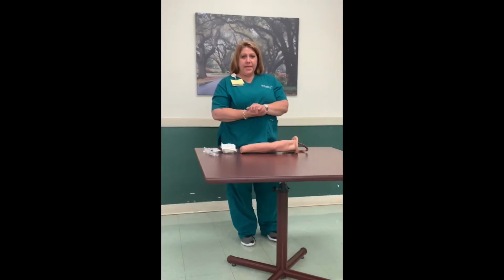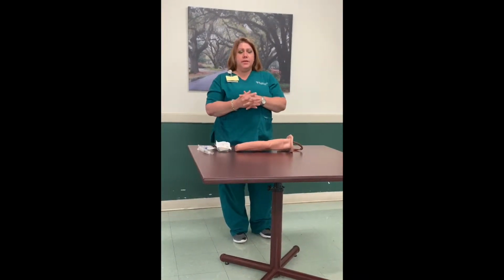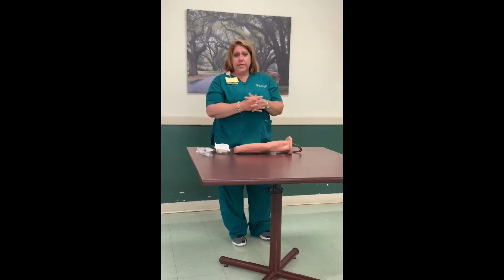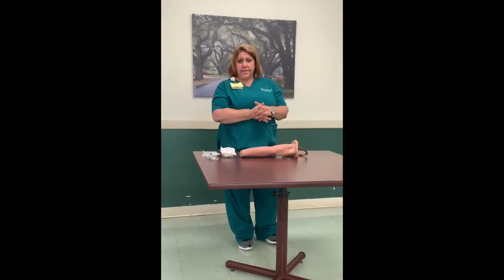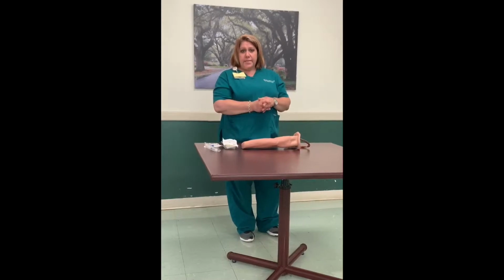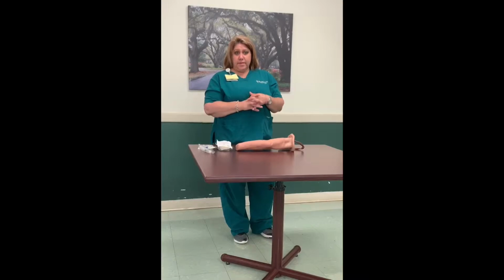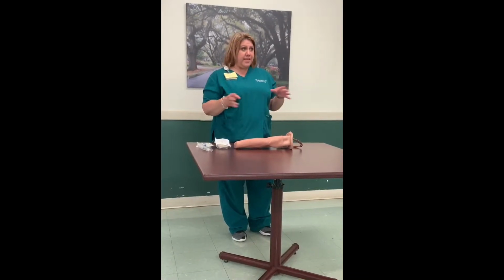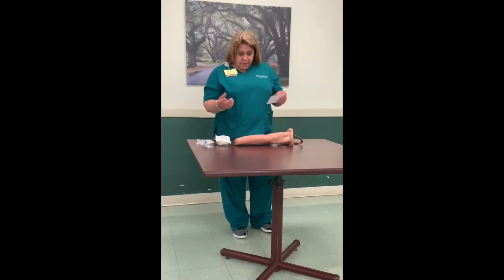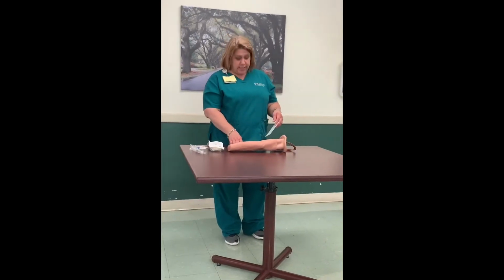So an IV is primarily used for therapeutic purposes such as medication administration, fluids, or blood products. It's the most commonly used intravenous device in hospitalized patients. It's usually done at bedside and performed with an aseptic technique, which just means to not contaminate the insertion site with pathogens. So you must wash your hands, wash your hands, wash your hands. That's all you're going to hear in nursing school: wash your hands.